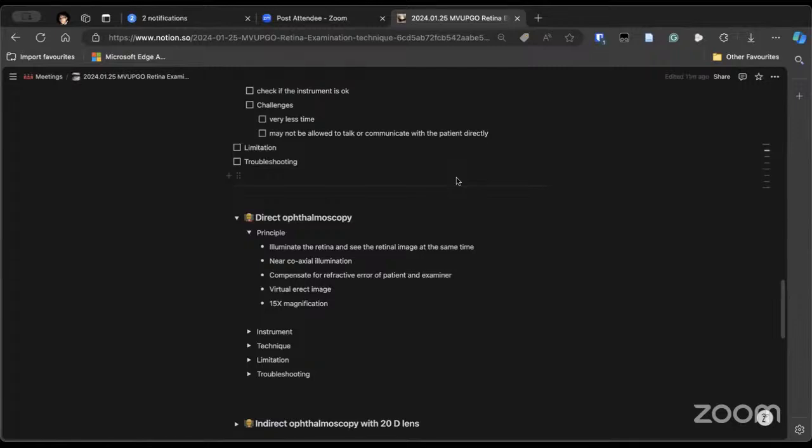That's why you need to see the patient when they are entering. See the glasses, whether they are thick, like myopic or hyperopic glasses or not. And you can also check what is called Bruckner's reflex, and that can give you a clue. Can any candidate tell us what Bruckner's reflex is?